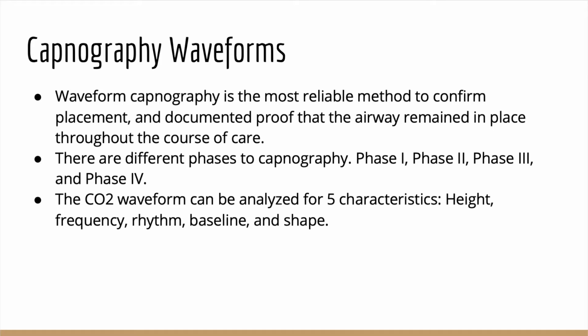In phase 3, there is CO2 recorded uniformly in the nose, mouth, and lungs. And lastly, phase 4 is called an end-tidal phase. It shows the start of inspiration. This phase is also called the descending phase because oxygen fills when inhalation begins and CO2 concentration decreases.